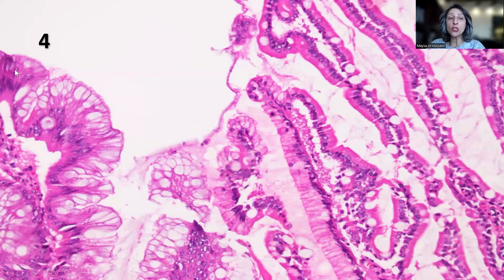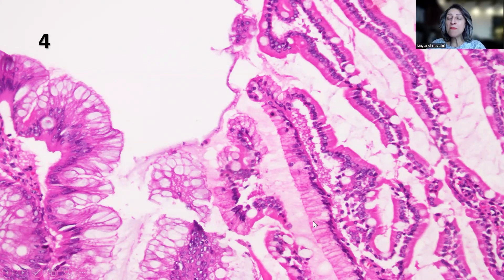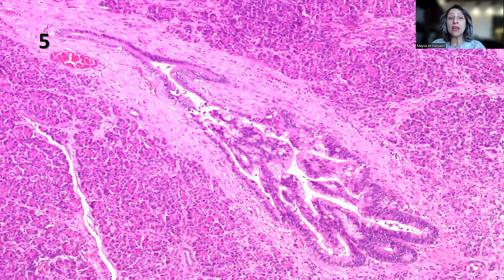In this area, you can see the same villous adenoma-like appearance with high-grade dysplasia, growing and creeping along the surface epithelium. And suddenly, we start to see the normal duodenal epithelium — a really nice depiction of the way these tumors sometimes grow along the epithelium.